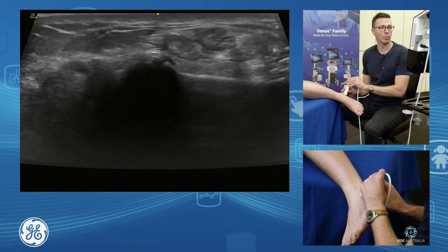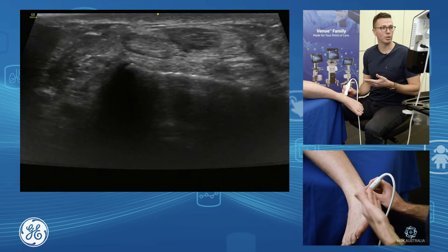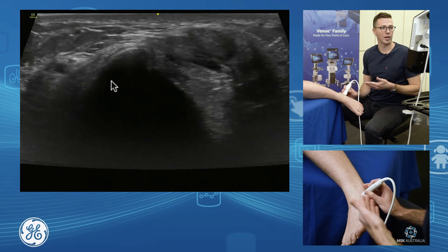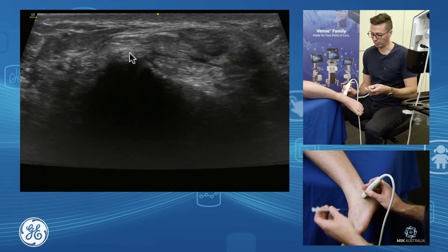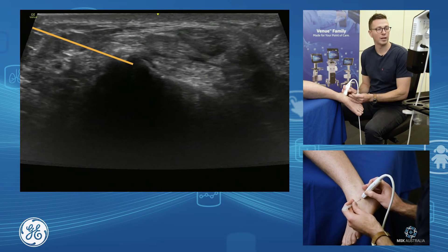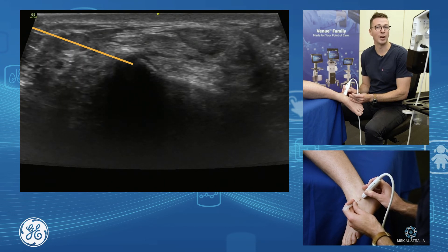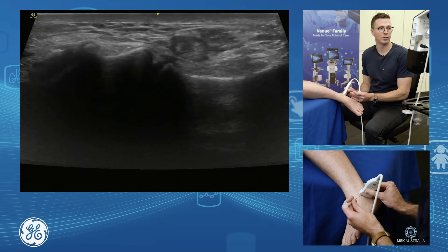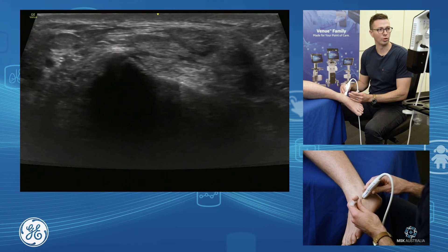Or you can bring your probe around longitudinal — go longitudinal, find your calcaneus and your talus. Here is the very front of the subtalar joint. Bring your needle down and in, hitting the front of the calcaneus, and it will flow into your subtalar joint. You can hit your sinus tarsi and subtalar joint all in one go, dropping down in short axis or long axis.